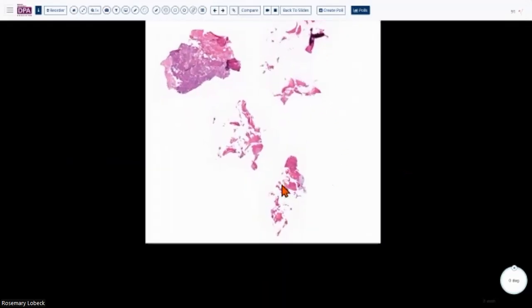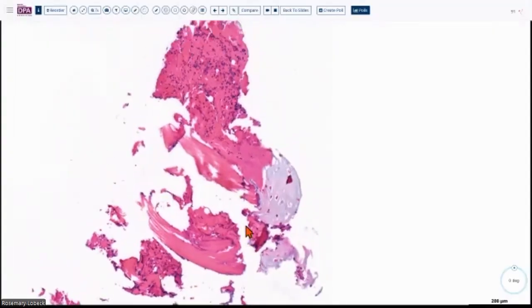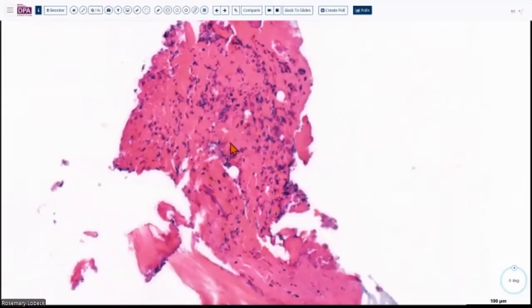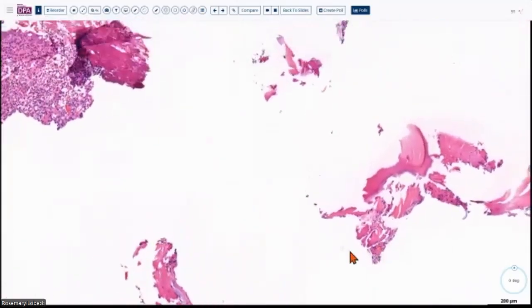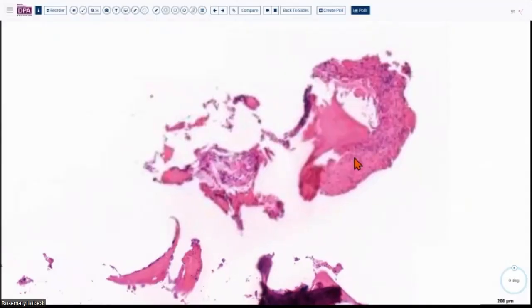So I want to start here, down here. You see this cartilage, and then you see this bone. So basically, there's an exudate associated with this cartilage, acute inflammation, no problem. It's acute osteomyelitis. Same picture here, broken bone, inflammation, acute osteomyelitis. So no problems at all.